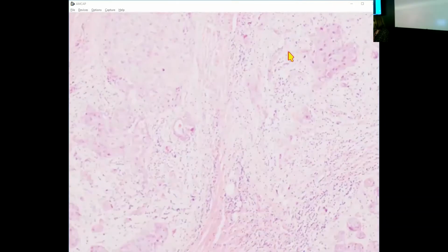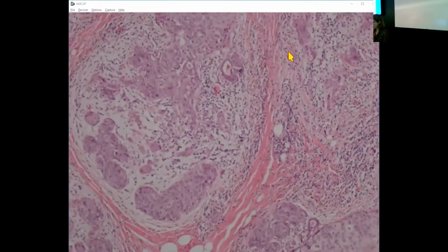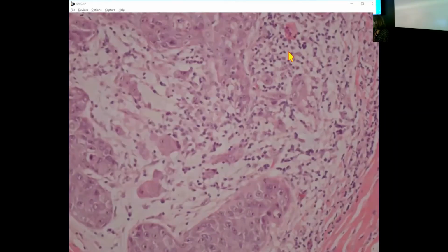So with cases like this, one can be confident about the microinvasion. But you could do myoepithelial cell markers if you felt unsure. It might be useful to do a keratin stain as well. You would see very nicely just how much invasion there is. If you have a combination of a keratin and P63, that's brilliant. HER2 is likely to also very nicely highlight the microinvasion.